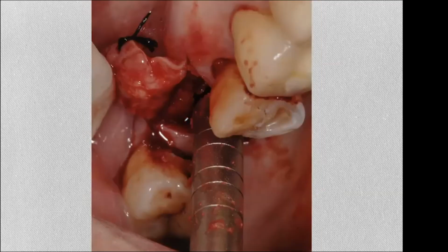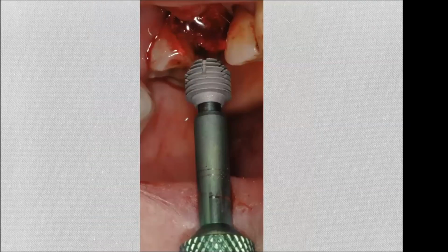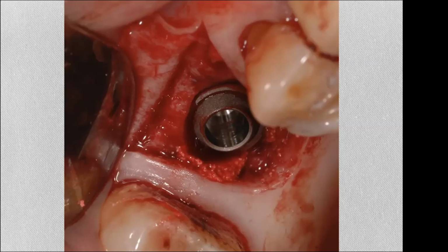Okay, we introduced the particles, and obviously gently. They moved fairly easily, and we introduced the implant fairly quickly there. Now we had quite a bit of those left. Now the implant is sitting fairly high in the socket. I would not close over that. This will be a cause for failure. We left quite a bit of bone on the facial, not so much on the palatal, slightly low. So I want it to be lower, okay?